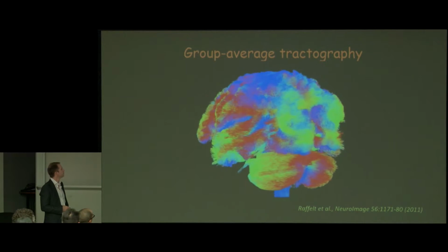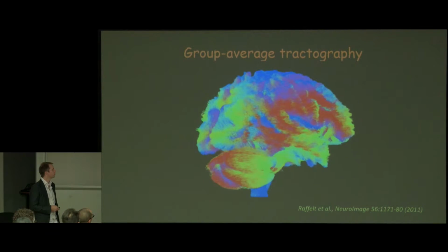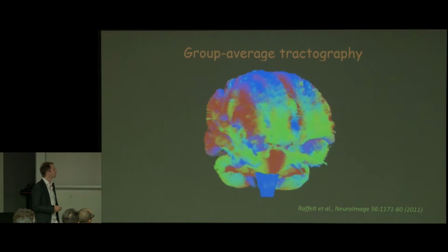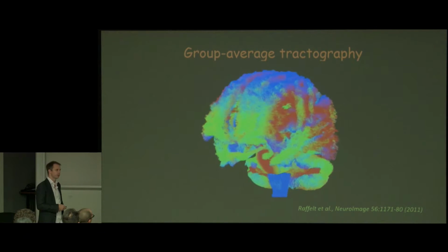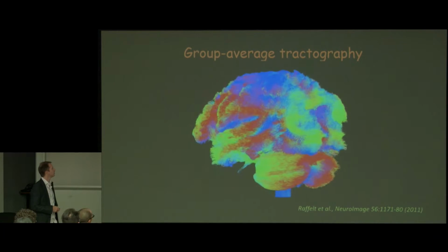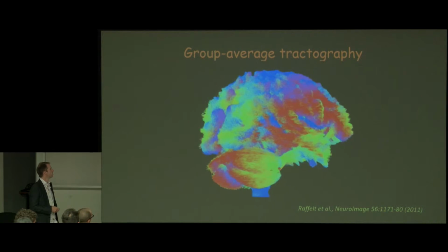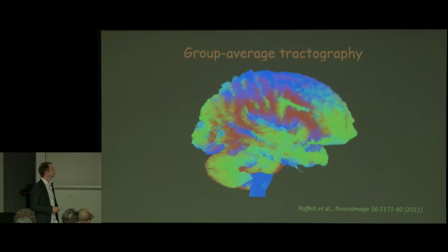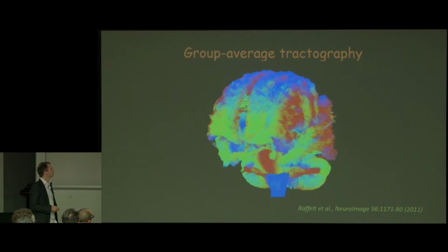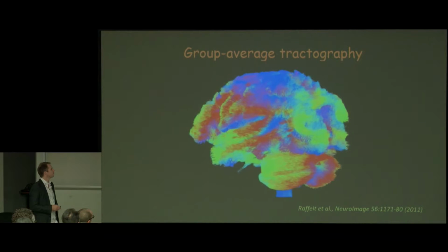There we go. What we can do with this, immediately you can start to do things that sound pretty cool, like tractography on the template. And that actually works remarkably well. We get a lot of the sulci preserved, and you get a lot of anatomy there that is actually quite encouraging to see. And these oculomotor nerves here. Or is that optic tract? I can't remember. So it looks great.